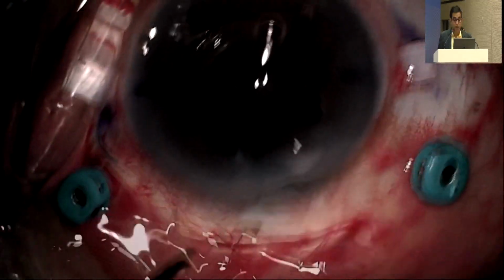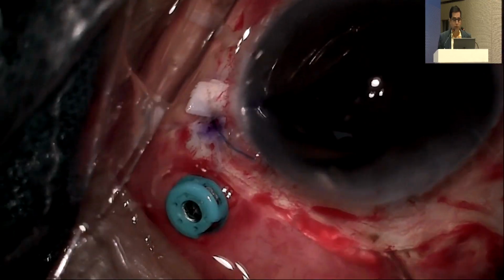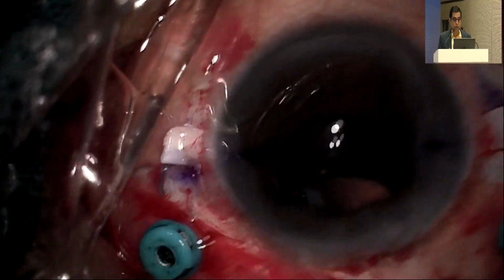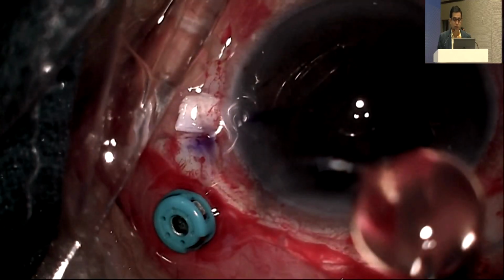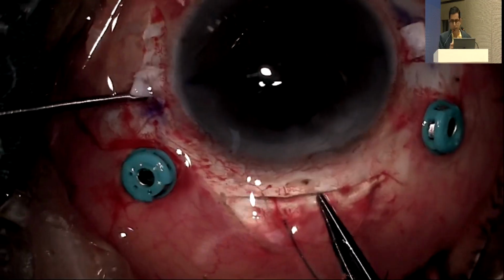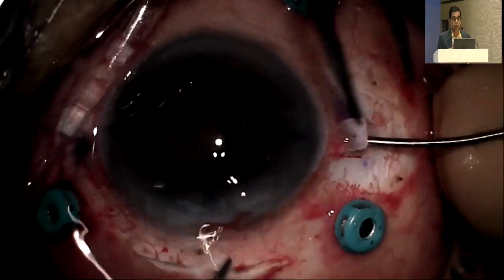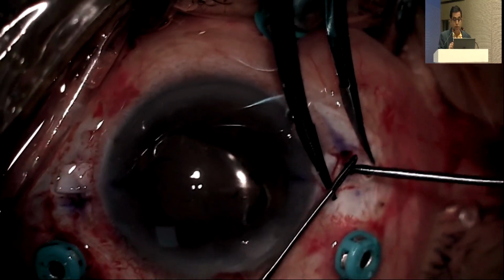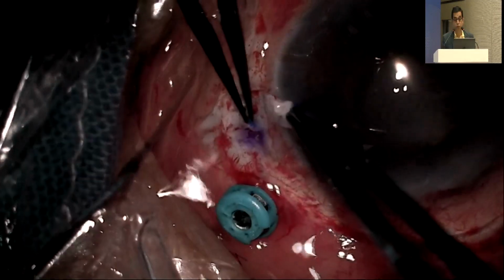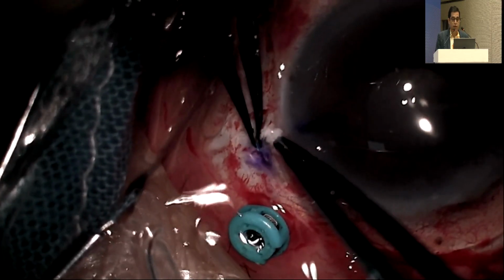So basically that's when the SOS comes, and the other surgeon takes over. Let's not get into details who did the first surgery and the second surgery, or rather the continuation of the surgery. So the IOL is taken out. So now you see what is the change in the surgical situation. Nothing except the air bubble is not there. So you are sure where the haptic is. You can hold the haptic and get the haptic out, and you can just tuck it in through the tunnels, and you can repose the flaps, and that's the end of the surgery.